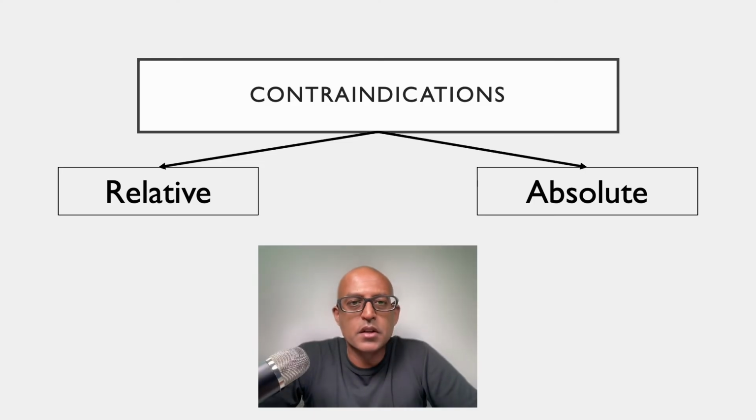Let's think about some of the contraindications when it comes to doing an ultrasound-guided intervention. To make it easier when you're discussing it with patients, it's useful to consider it as either relative or absolute contraindications to any type of procedure.